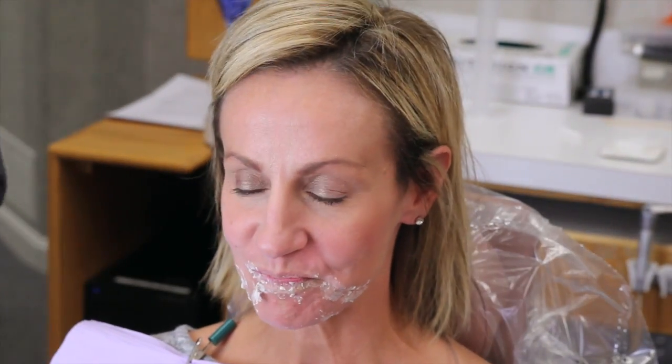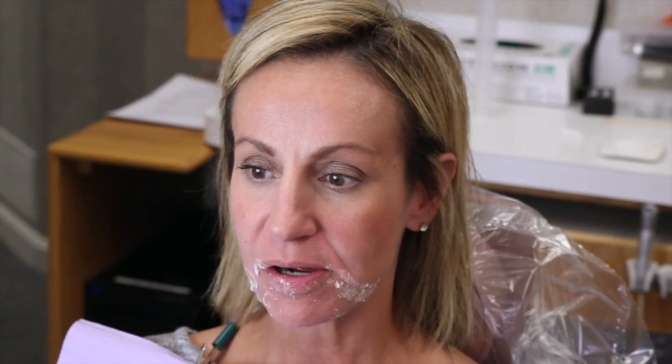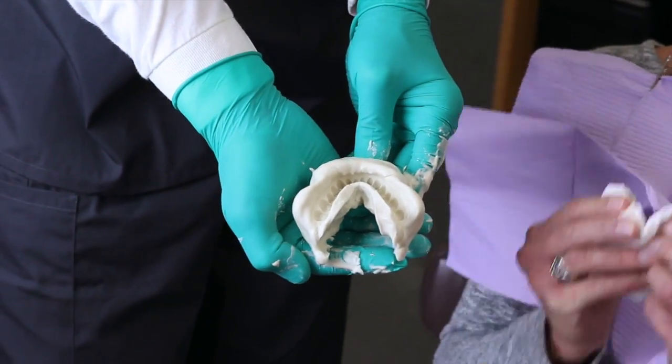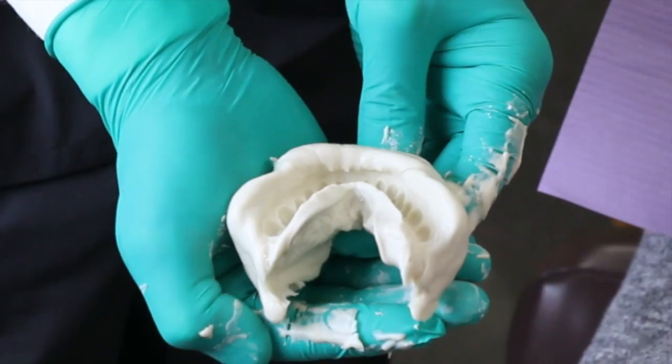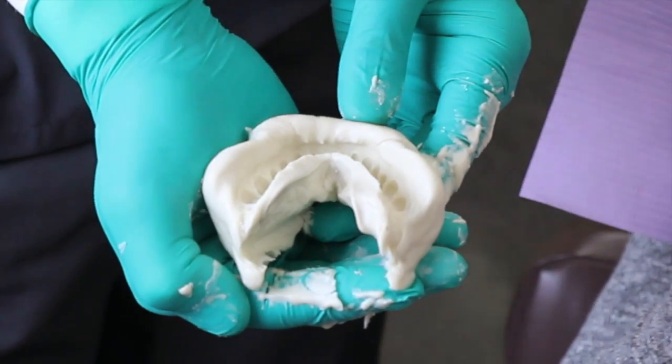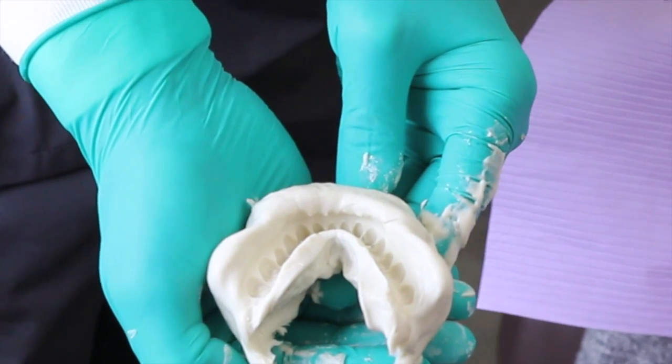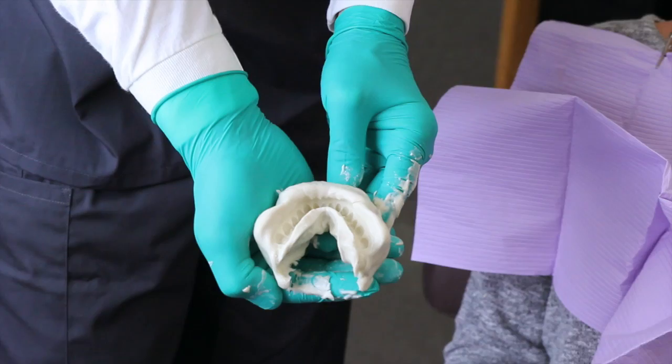Okay, great. Again, take a little, get an idea of the impression. Okay, and we'll show close-ups of these. So you can see very, very nice border extension, maybe a little overextended here on the buccal portions, but very nice. And we'll go ahead and get these poured up, and then we'll talk about that, and then we'll take a look at the final results afterwards.